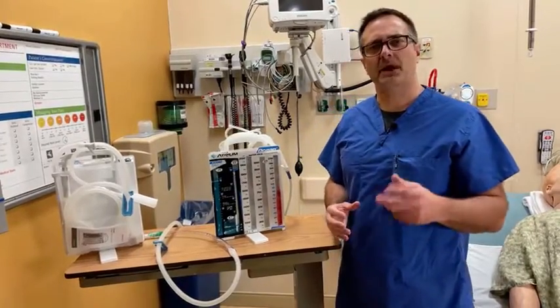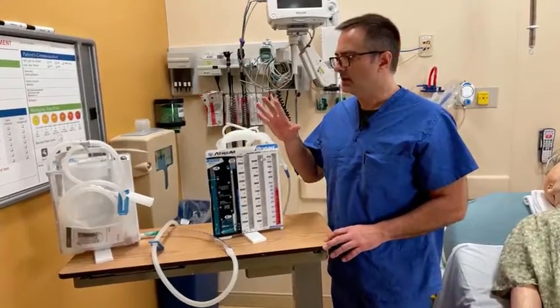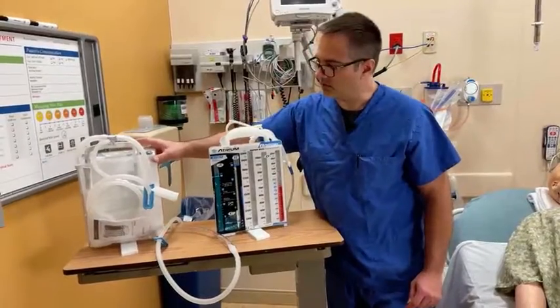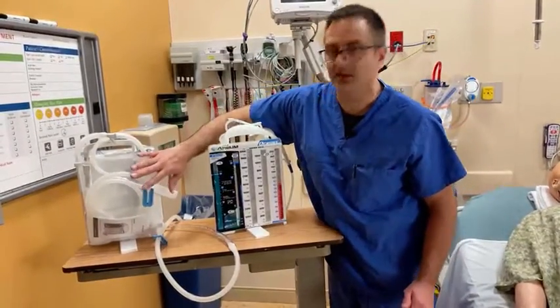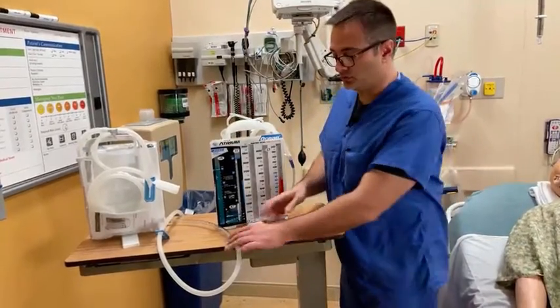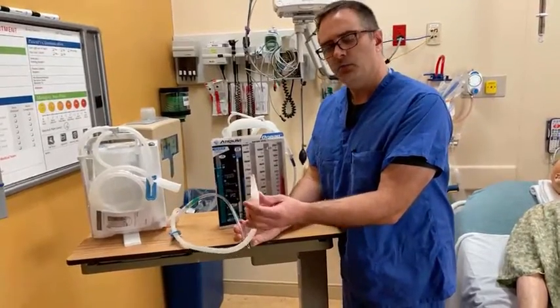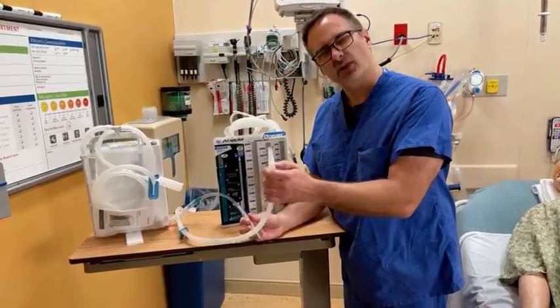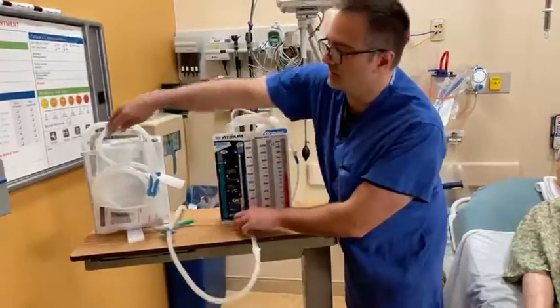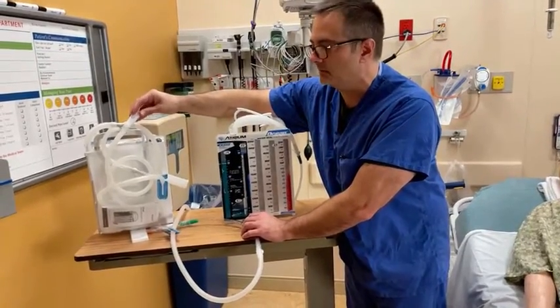Okay, so here we are. We're back with our chest drainage systems, and I want to point out a couple more features before we turn on our suction. You'll notice I have this other chest drainage system over here, and on the back I have this tubing in a bag. This tubing is what connects to my thoracostomy tube, or the chest tube that the provider is putting into the patient. We really want to strive to keep this end sterile. So I recommend while you're setting up your chest drain to keep it in the package and to keep the protective cap on top until you're ready to use it and hand it to the provider.